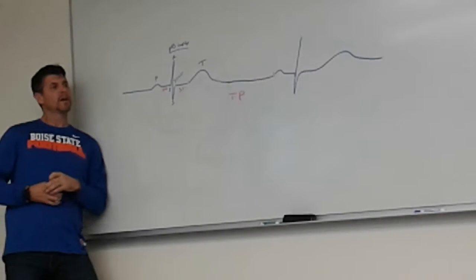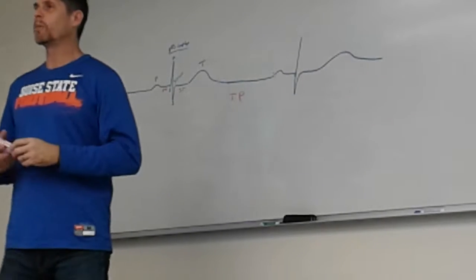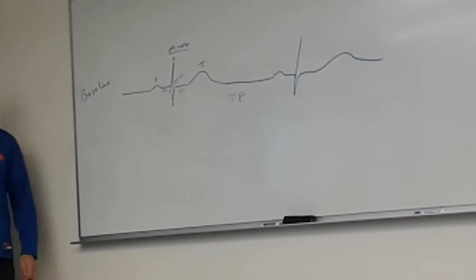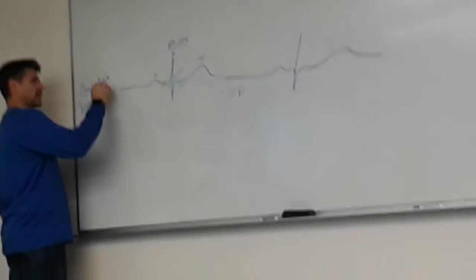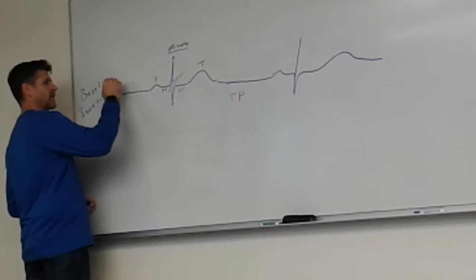Okay. So the baseline can go by two different names. You either have baseline, which is perfectly fine to refer to it as, or you also can refer to it as the isoelectric line.